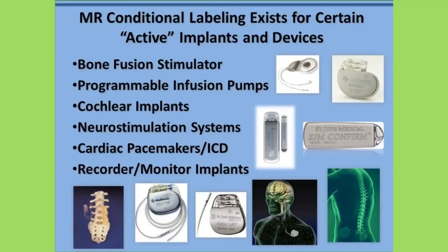However, because comprehensive studies have now defined acceptable conditions for certain devices, there are now several active implants that are acceptable for patients undergoing MRI, including at least one bone fusion stimulator, certain programmable infusion pumps, certain cochlear implants, various neural stimulation systems, and in fact, there are now even cardiac pacemakers and at least one cardioverter defibrillator, or ICD, with MR conditional labeling. In addition, there are now cardiac monitors and recorders that have been labeled MR conditional.